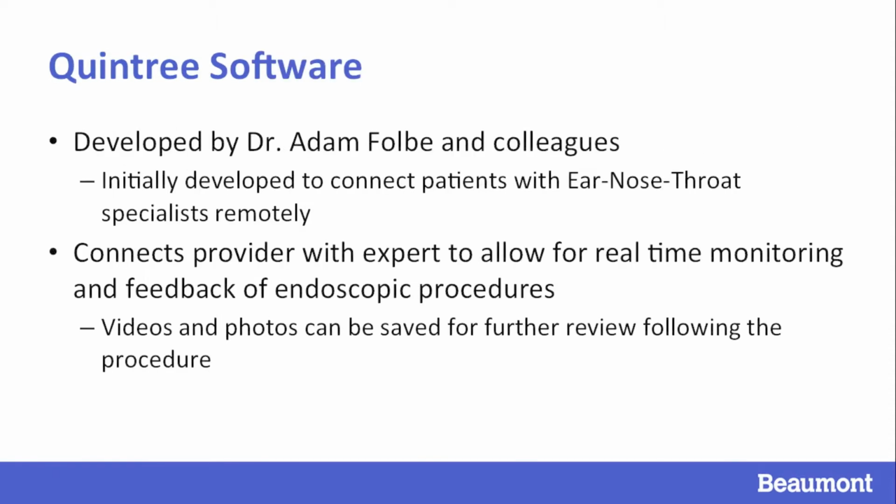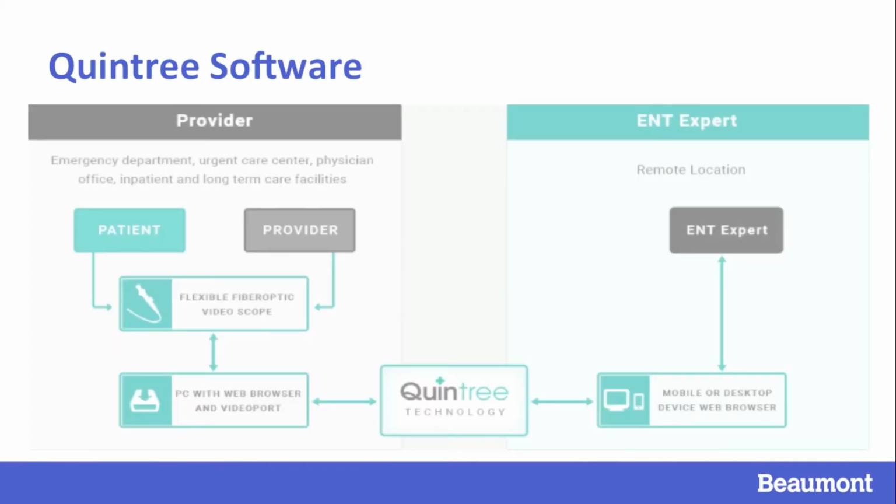Quintree Software is the interface utilized for performance of remote cystoscopy. Initially developed for otolaryngology, we have adapted this technology for its use in bedside flexible cystoscopy remotely. Procedures are performed with the provider at the patient's bedside and the expert logged on remotely through the Quintree interface, watching the procedure in real time. Experts have the ability to communicate back and forth with both the provider and patient, as well as save photos and document notes within each encounter.